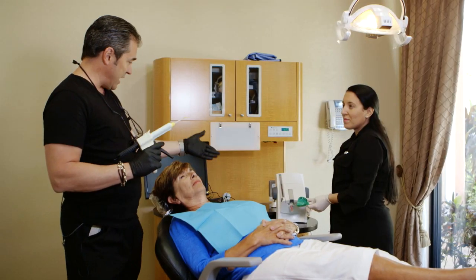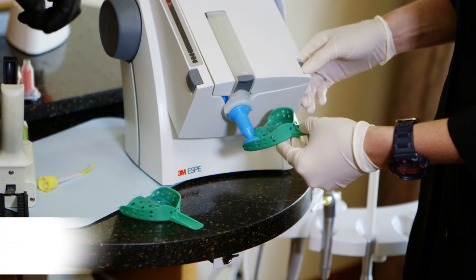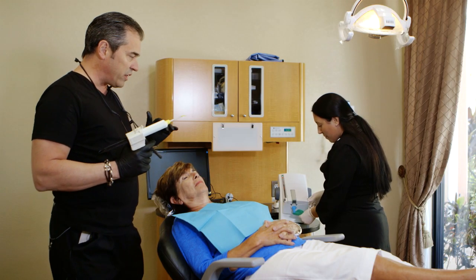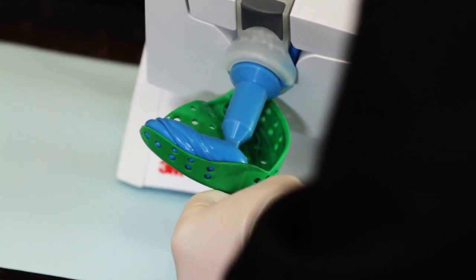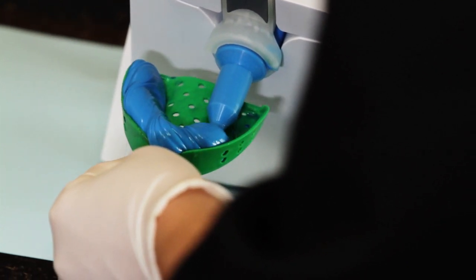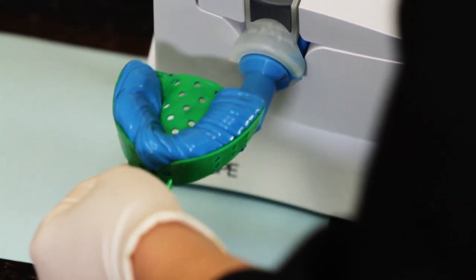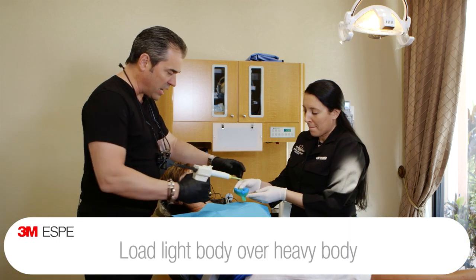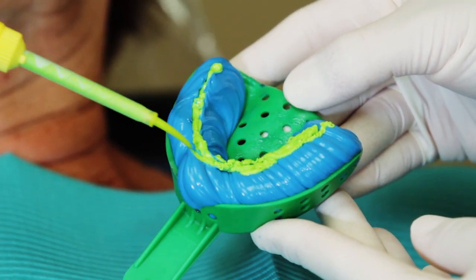So we're gonna go ahead and load the heavy body right now from the Pentamix machine. Earlier you heard me say things about efficiency, and one of the things I love about efficiency is this machine loads very quickly without a physical exertion put on the dental assistant. So we're able to load in a very consistent, equal amount into the tray, into the heavy body. Now my preference is to take the light body and go right into the tray as well, as you'll see me do right now. I'm gonna load some right into here after I bleed some out. So we're gonna bleed some out, and then I will simply load some right into the tray as we get ready to go into the mouth.